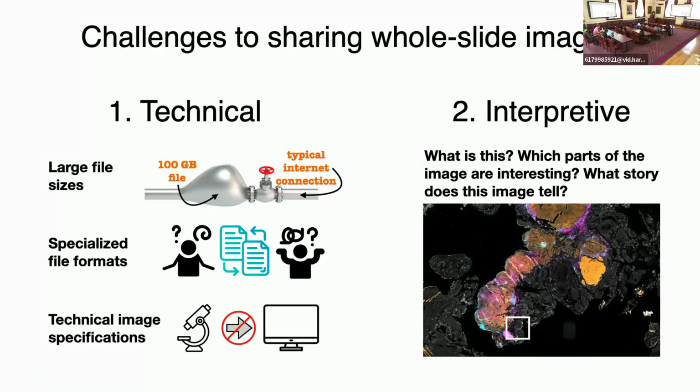Well, there's some challenges to that. One of them is technical. Files are huge. I said they're 100 gigabytes, maybe more. We can download them on campus. We're blessed with a good internet connection, but if you're somewhere else in the world, with not a great internet connection, that's not going to be feasible.